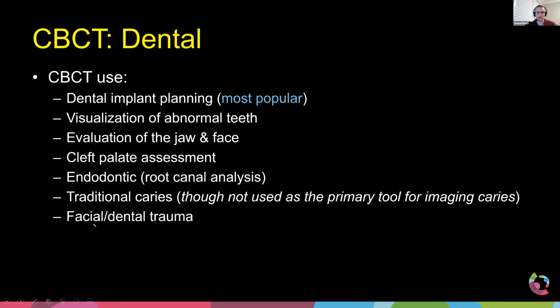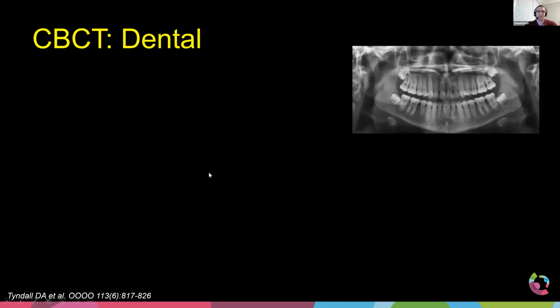There's going to be, of course, probably the second most common use for this, I guess I should have put this on the list a little higher, and that is when you have facial or dental trauma. And so you need to visualize the extent of the trauma with respect to the rest of the oral cavity.